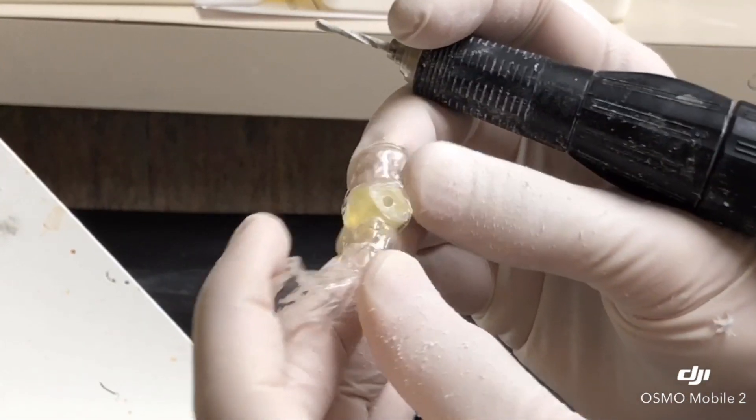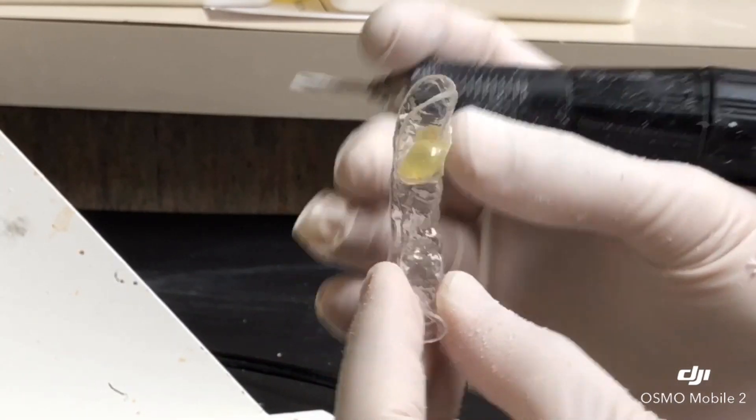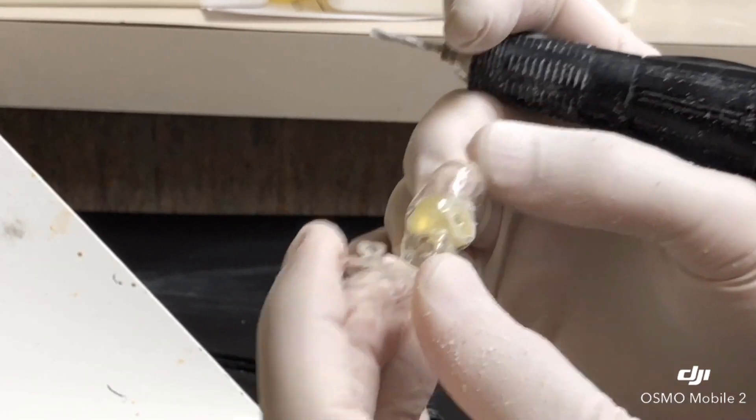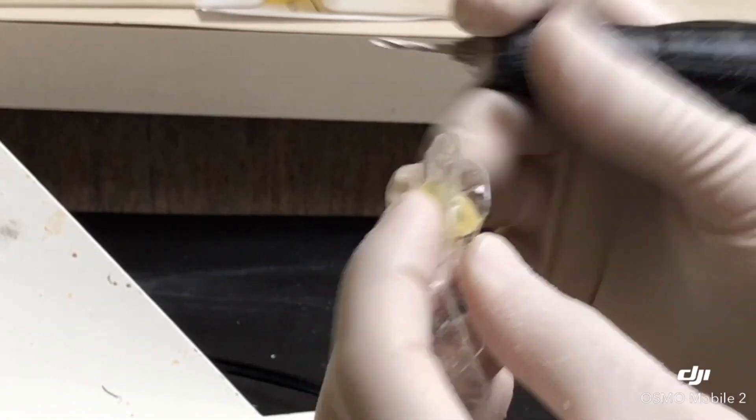We're going to drop this in some antiseptic liquid such as Peridex — chlorhexidine — so it stays sterile. We want to make sure all these debris are removed and we're ready to go.